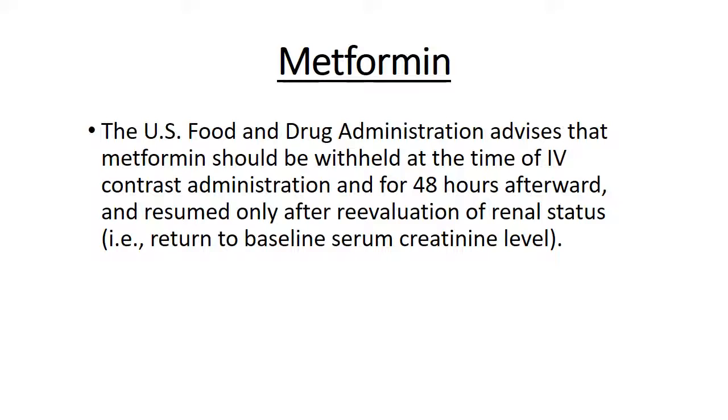The problem, however, is that most of the time we're getting scans done on a non-elective basis, meaning that they're needing the scan done acutely. Therefore, you don't have the luxury of waiting 2 days with the metformin held in order to do the CT scan. Someone you think might have appendicitis, you don't hold the metformin for 2 days and then scan them. But you should absolutely hold it for 48 hours after the scan. Have the patient drink lots of fluids or give them IV fluids to flush their system good. Make sure their creatinine gets back to their normal creatinine level, and then you can restart the metformin at that time. And again, the reason being because if you don't, you risk lactic acidosis.